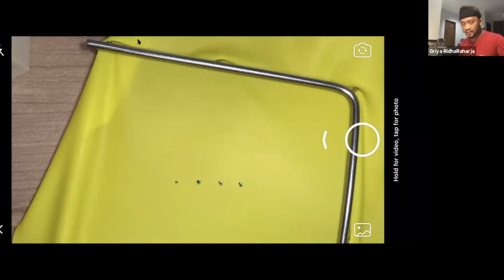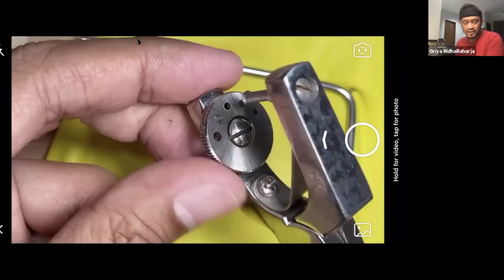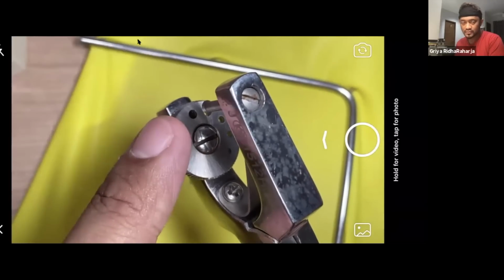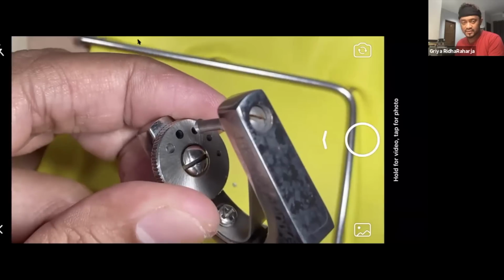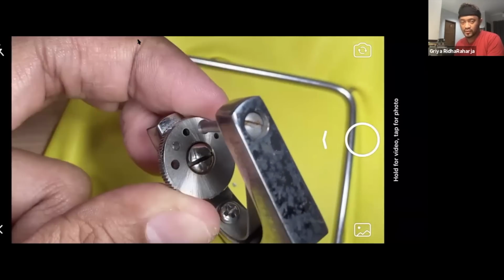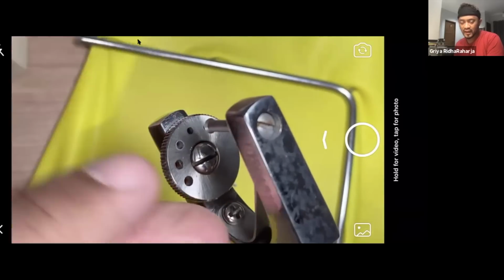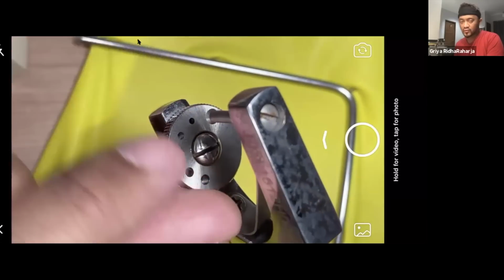Now I will make the hole. So which hole is the best? See, this is for clamp. Yeah, this is so big. I don't recommend you to do it on the molar. Yeah, this is for clamp only. And how about this? The second one is for molar. This is for premolar. This is for, sorry, this is for anterior upper, and this is for anterior lower.